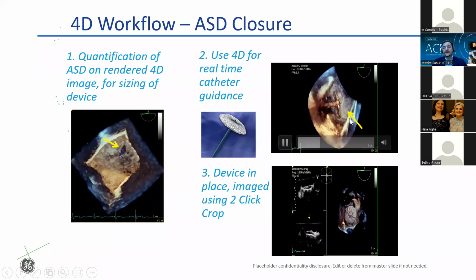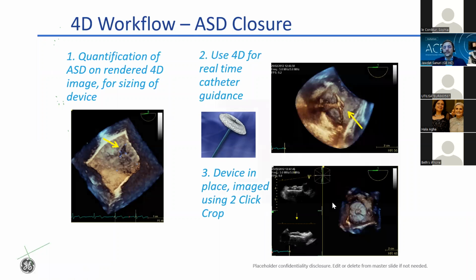And here, this is an example of an Amplatzer, an ASD closure device, where only the disc that is in the left side is open, right side is still not open. You have to pull it back, of course, and then open the right side as well.